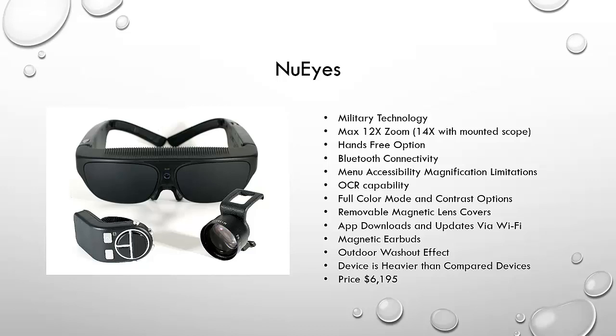NuEyes does have OCR capability. There is a full color mode with varying contrast options, though not as many as eSight, and the full color mode has a slight green tint that skews the color a bit. The removable magnetic lens covers are an interesting function — you can pop the lenses out and see the image like a hologram displayed in front of you while seeing around it with your usable vision. In practice, it's easier to see the image with the lenses in, particularly in an indoor setting with controlled lighting. The slats on top of the device allow heat to escape, as the built-in battery pack makes it run quite hot.